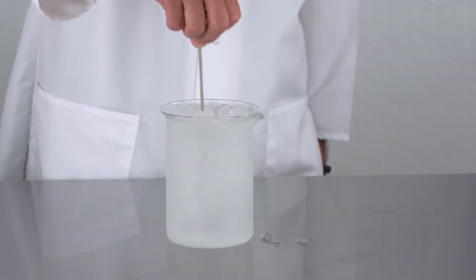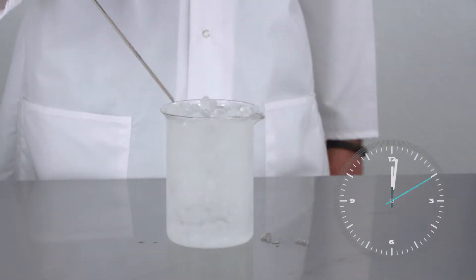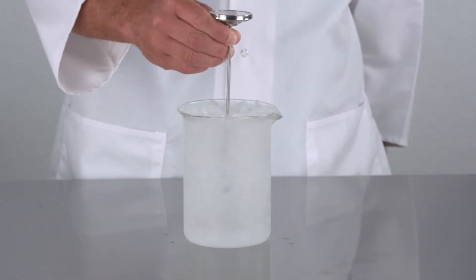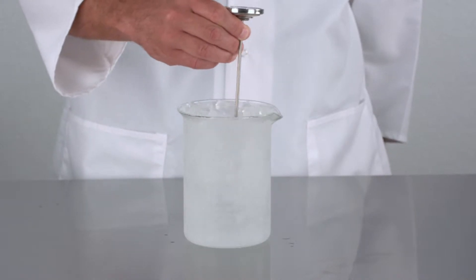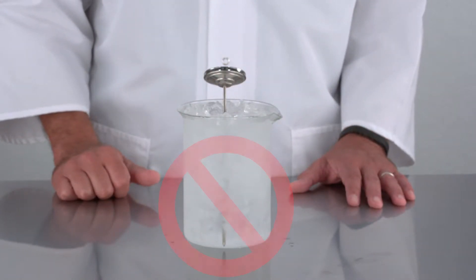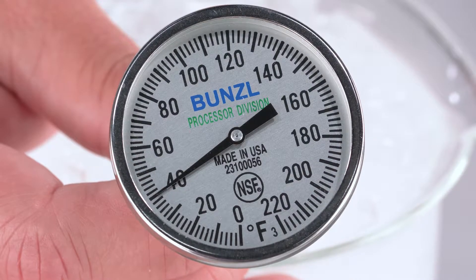Stir the water and let it set for two minutes. Insert your thermometer about two to three inches into the ice bath and use the thermometer to stir the ice. Avoid having the thermometer touch the sides or bottom of the container. Your reading should be 32 degrees.